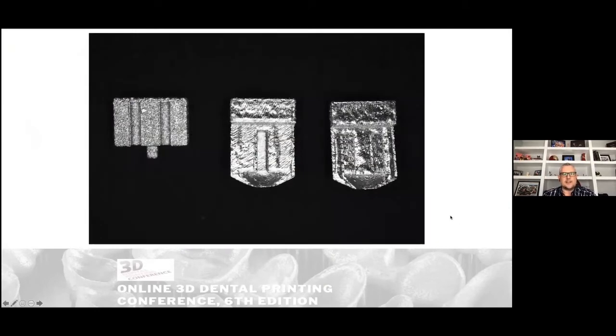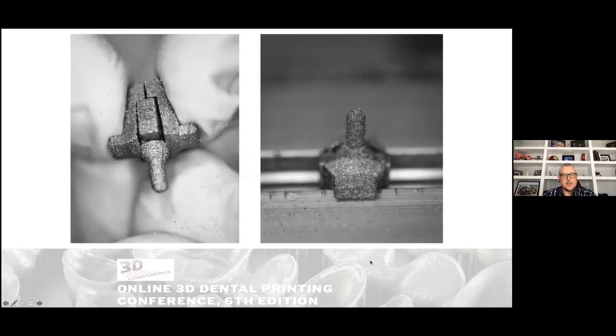So this is more of a visual exercise. So this had to be designed. This is actually the receptacle to hold the implant, okay? So this was designed and also additively manufactured in metal. So what you're seeing here is this is our little holder, and this is our abutment, and the pins are inside, and this is now within a vise.